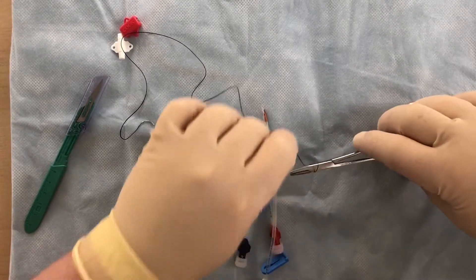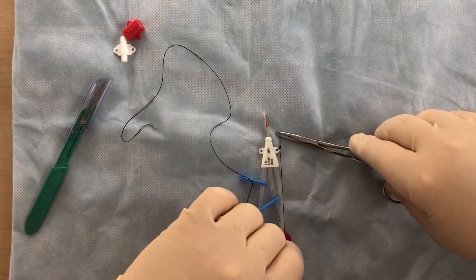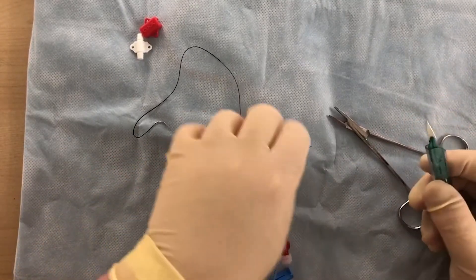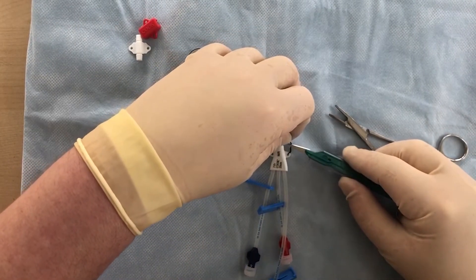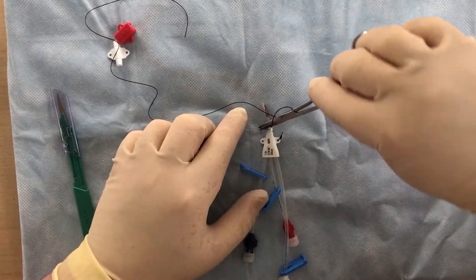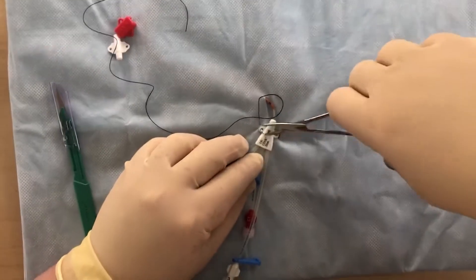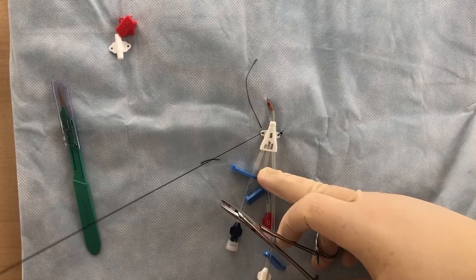I do a couple of throws there just to make sure the knot is secure. This is silk in this case, so it doesn't take very many throws because it has a good purchase on itself since it's a braided line. Then I'll use the scalpel that came with the kit just because it's readily available — carefully cut that. Take a nice bite of the patient's skin and up through the area again, and just repeat — wash, rinse, and repeat.